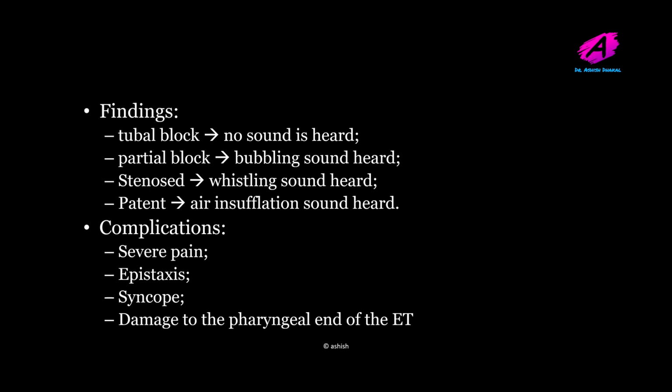So the findings in this test: if there is tubal blockage, no sound is heard with the auscultation tube. If there is partial blockage, bubbling sound would be heard. If the Eustachian tube is stenosed, whistling sound is heard. If it is patent, air insufflation sound is heard.